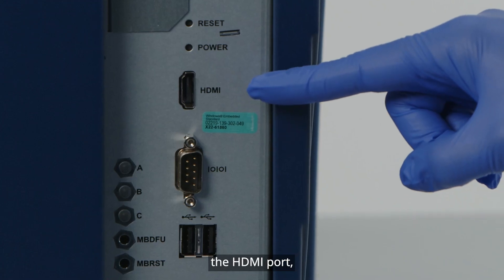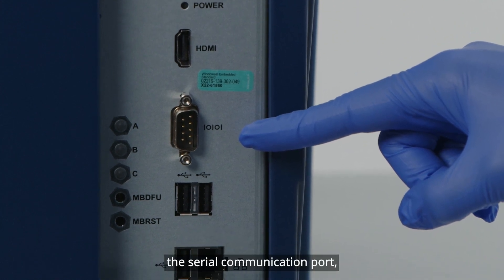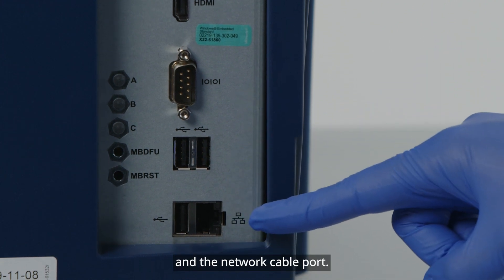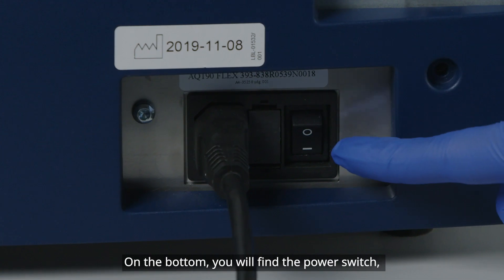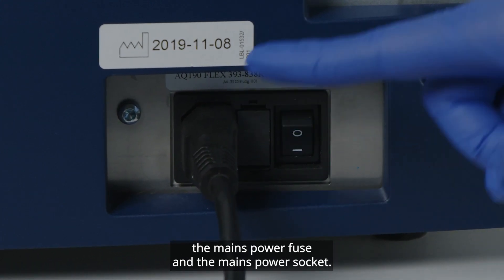The HDMI port, the barcode reader port, the serial communication port, USB ports, and the network cable port. On the bottom, you will find the power switch, the mains power fuse, and the mains power socket.